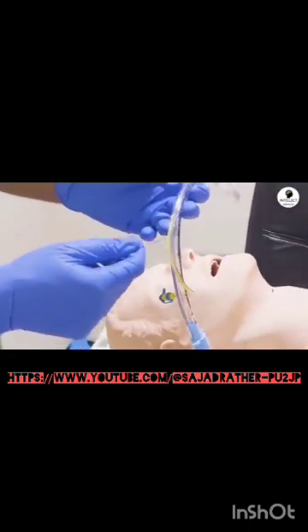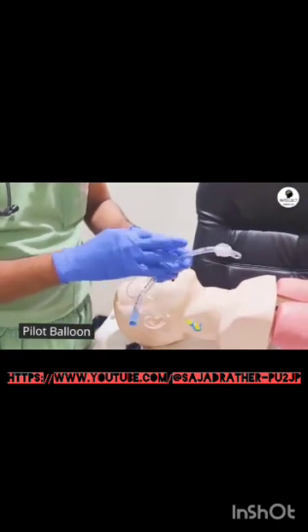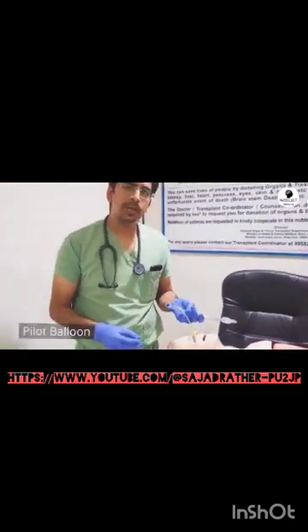This is called the pilot balloon. From here, you can inflate the cuff. In an adult population, we try to intubate a patient with a cuffed endotracheal tube so as to prevent any kind of aspiration, right?